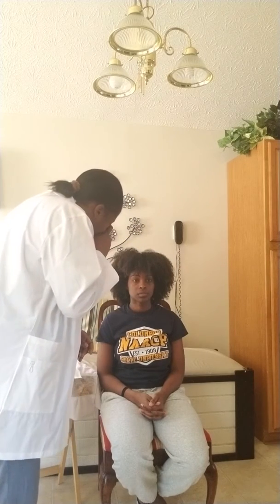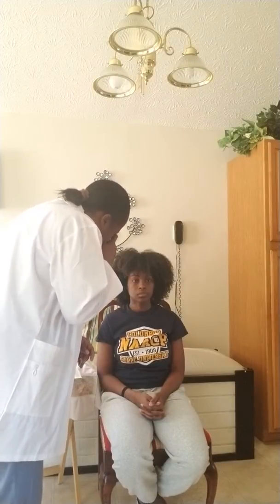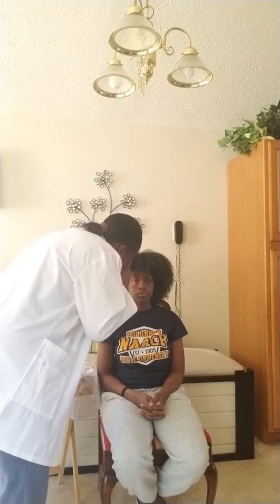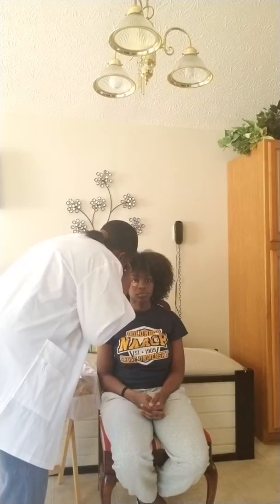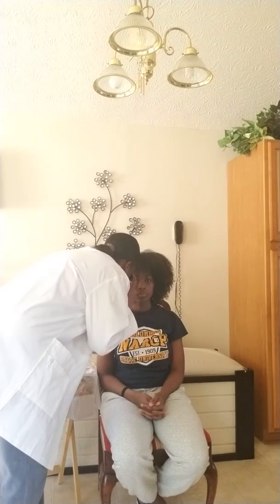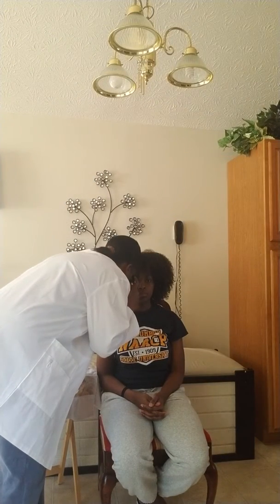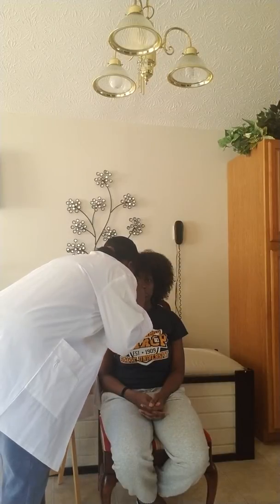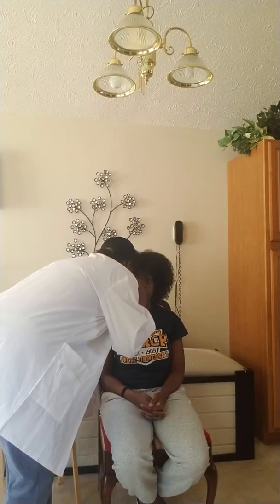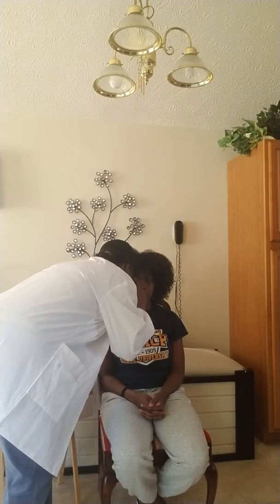First, I'm going to find the red eye reflex. Then I'm going to come in and get real close to do this. I found the red eye reflex, and then I'm going to try to follow the optic, follow all behind the blood vessels. And hers is within normal limits. Usually the measurement's about 0.3, and hers is on that side.